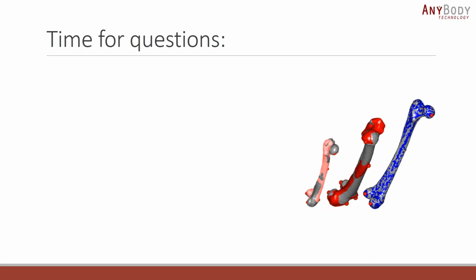I see a couple of questions. I'm reading the first one. Can we pick landmarks in Anybody software, or do we need to use external software? Yes, you can pick up landmarks in Anybody, but it may not be the easiest way to do it. So I normally pick them up in some external packages, and there are fantastic packages like Mimics and MeshLab and many others. I think next generations of Anybody will simply read those files in.